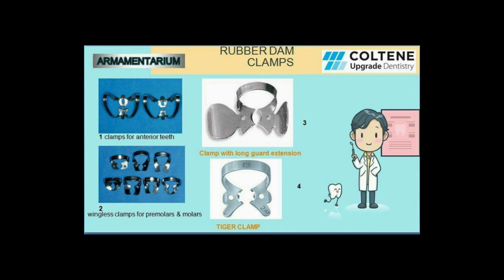The lower one is a tiger clamp. As you can see, the jaws here are serrated. These are serrated for extra retention. Now extra retention can be needed on teeth which are severely broken down, and sometimes these are also needed on deciduous teeth too.